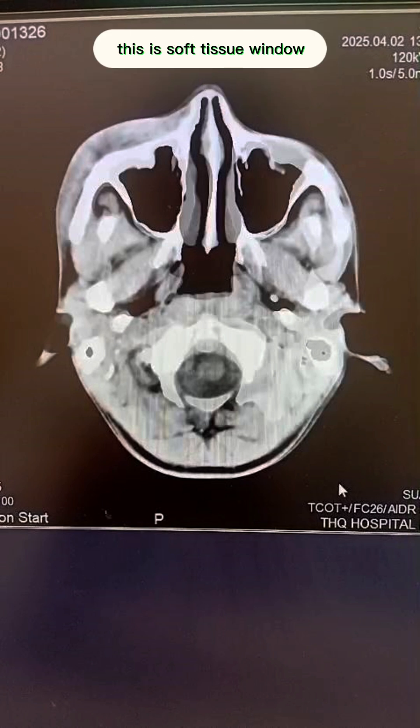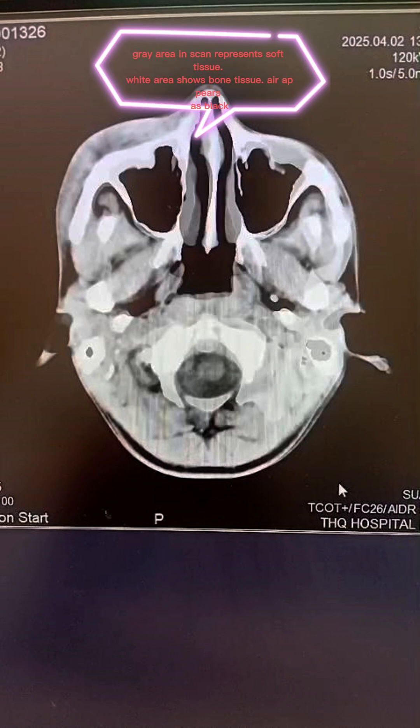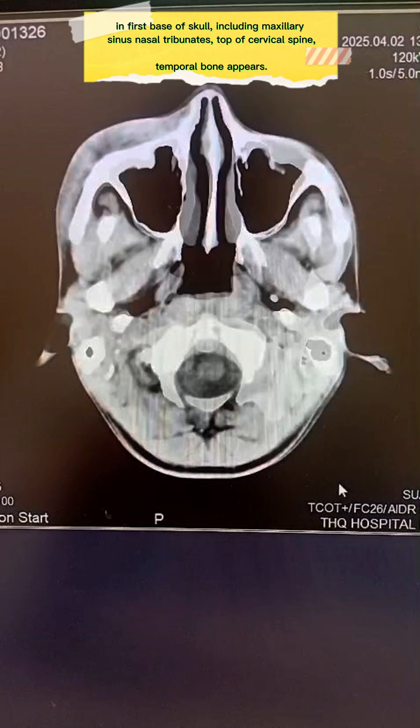This is the soft tissue window. The gray area in the skin represents soft tissue, the white area shows bone tissue, and hair appears as black.